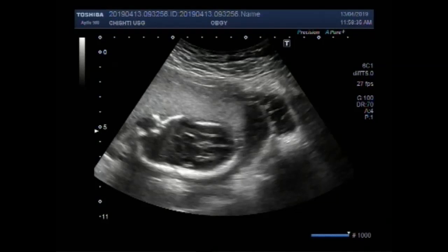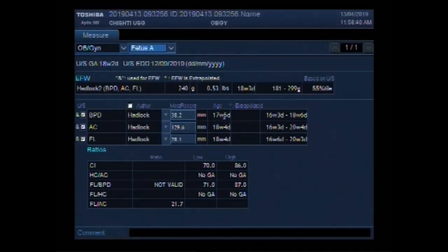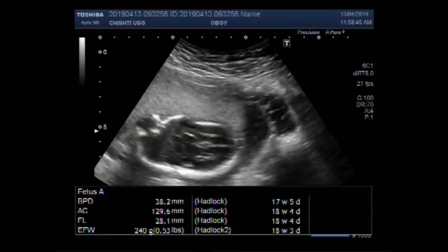Dear viewers, I hope you are all fine. This ultrasound video shows an intrauterine fetal demise with a pregnancy of about 18 weeks.